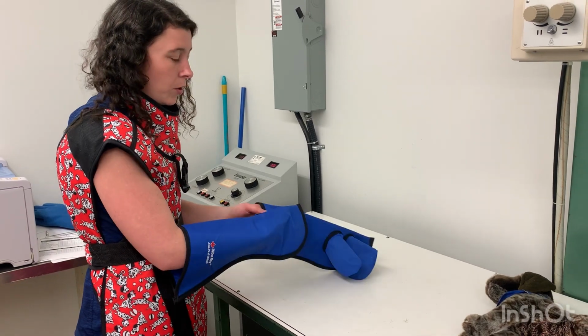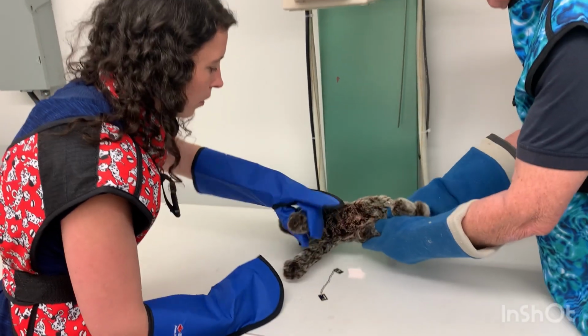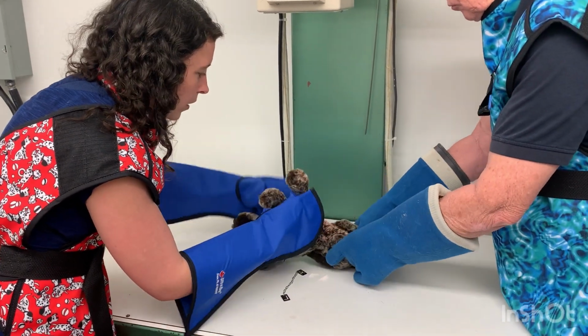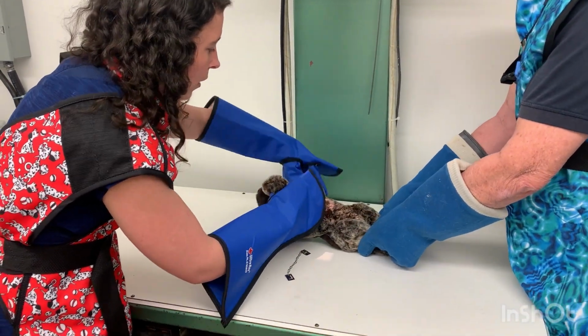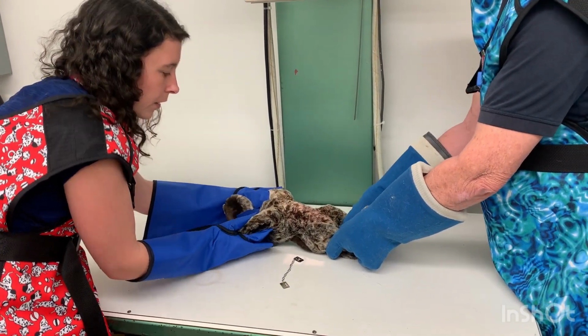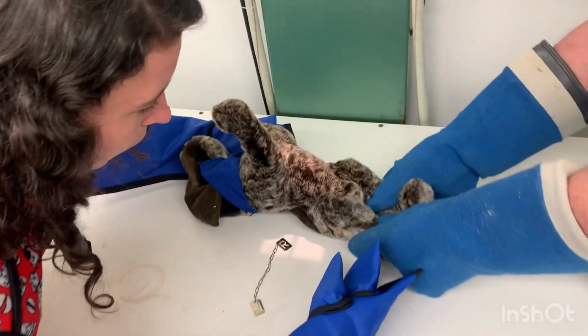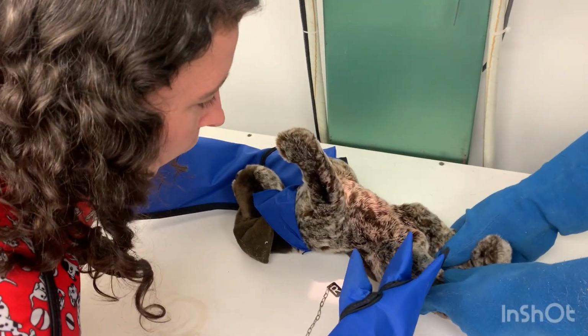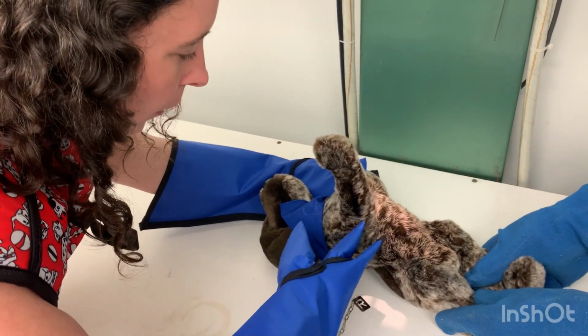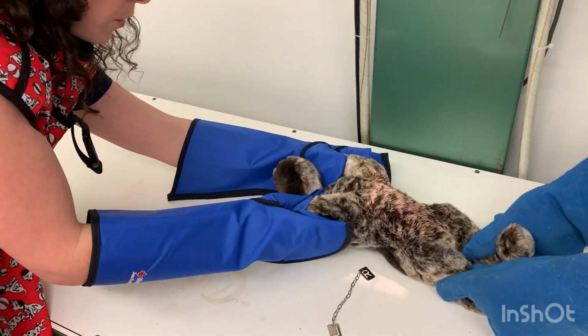We're ready to go, so we're just going to reposition our patient here. We're going to be turning our patient into a ventral dorsal position. So you take the back legs and you're going to need to extend them back. Now I'm going to make sure I'm holding onto the sides of the head here, and we're going to look at our collimation again. So we want to make sure our collimation field is going to about here and about here. So we're getting from the 8th rib all the way to the greater trochanters again.